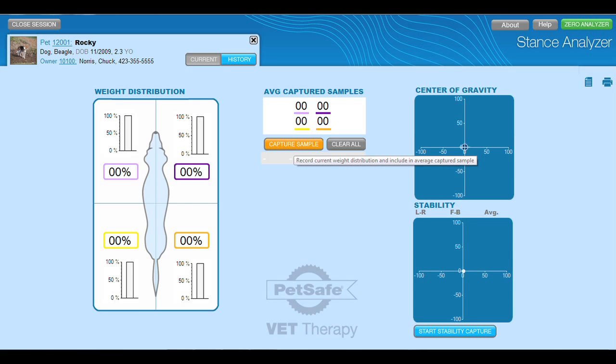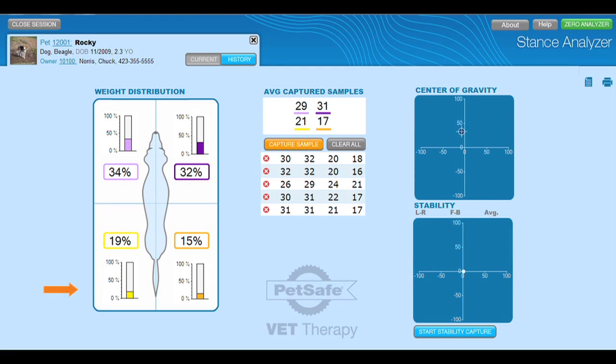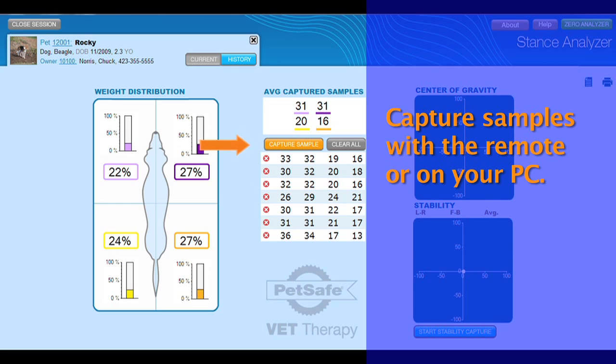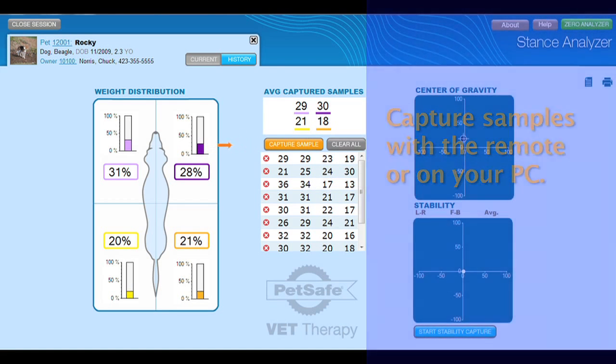Let's take a look at the Stance Analyzer software. We are now looking at the current tab of the Stance Analyzer. This is where you will collect all of your data and take notes for this particular session. The first thing you will notice is the weight distribution map, which gives you an instantaneous view of the animal's bearing weight — this is the data you will be collecting. Next to the weight distribution map is the average captured samples section, where you will see all of the data collected during a session. The top box is the average of all your captured samples.